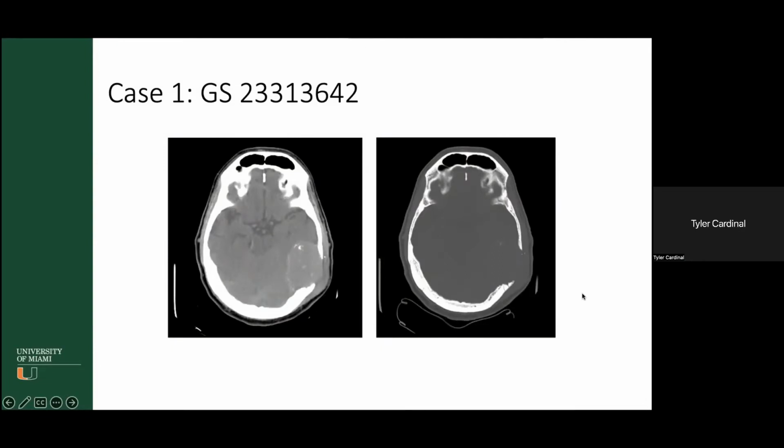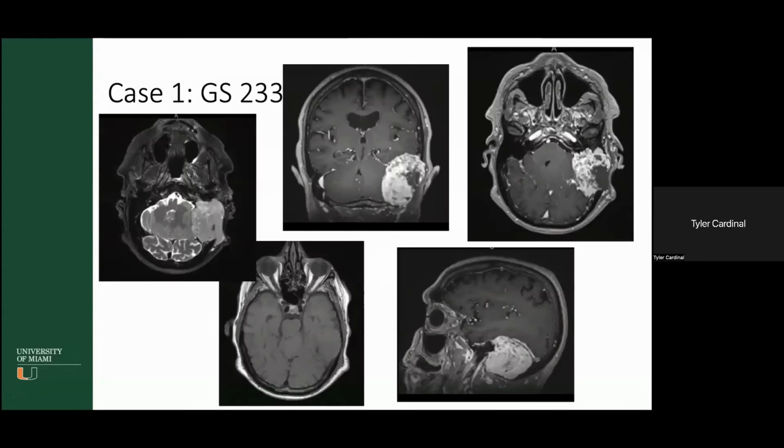And then did this patient have a craniotomy before, or is this invading through the bone? Yeah, exactly. So it's eroding through the bone, windows on the right here. You can see it's kind of eroding through the bone. So yeah, you're right, mass in the temporal region here. We're just seeing one slice, but eroding through the bone. So what other imaging would you like? MRI. All right, here you go.